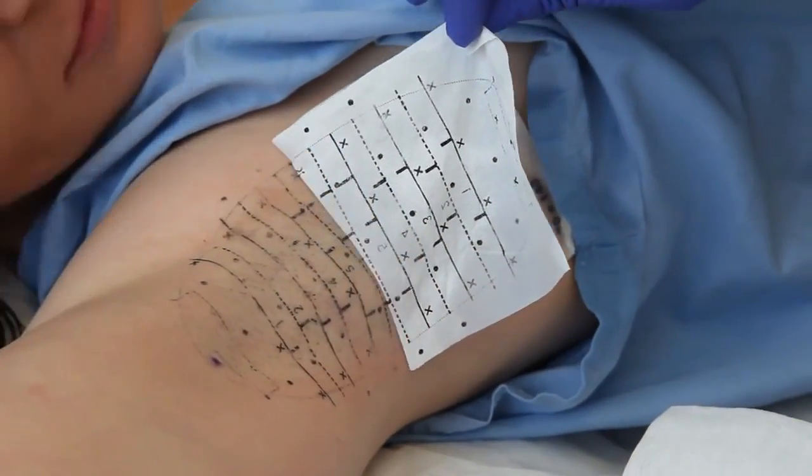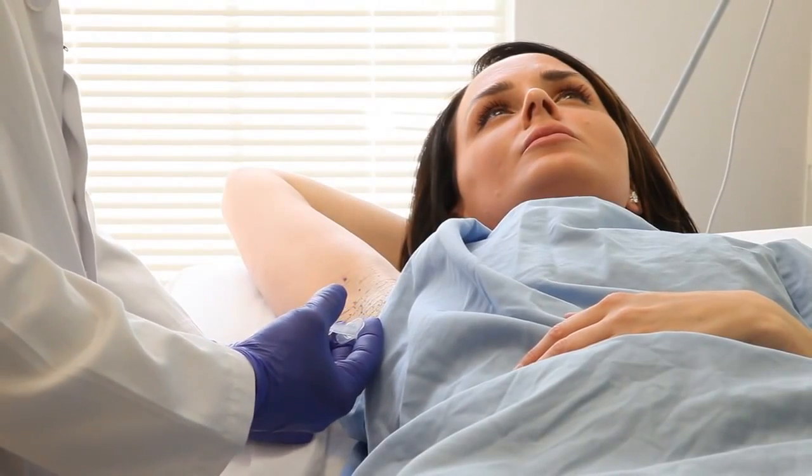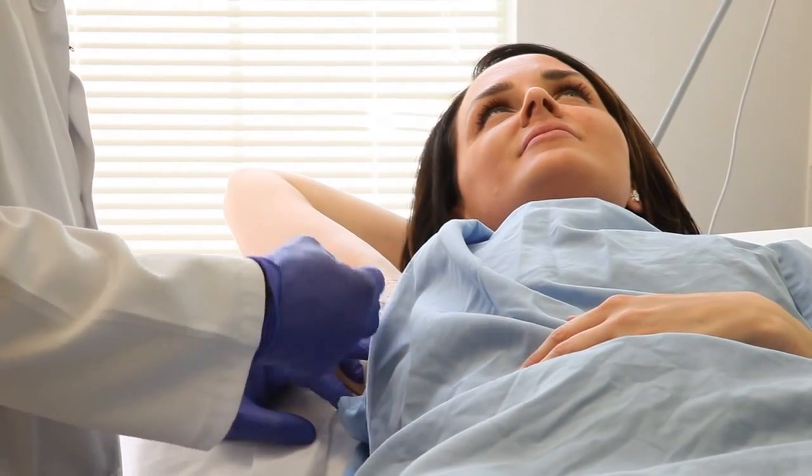Once we have that all drawn out, we numb you up. It's akin to what you get at the dentist, and most patients, after one or two injections in certain areas of the arm, don't really feel it after that.